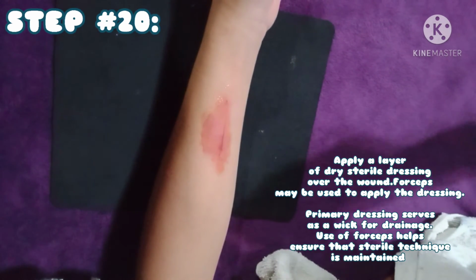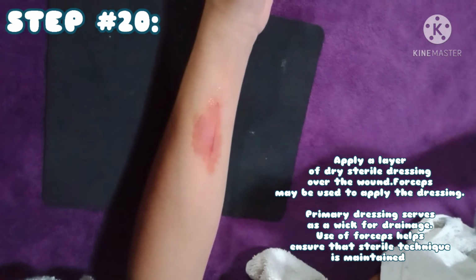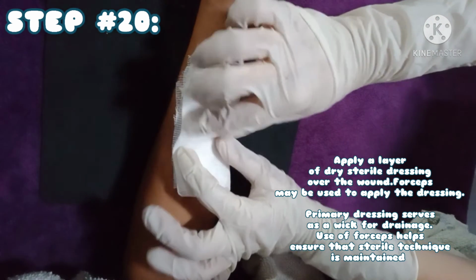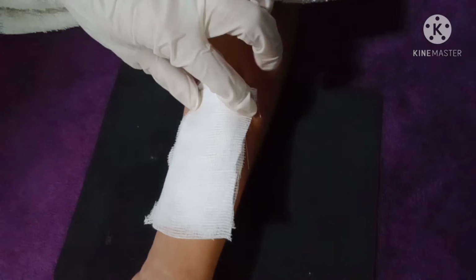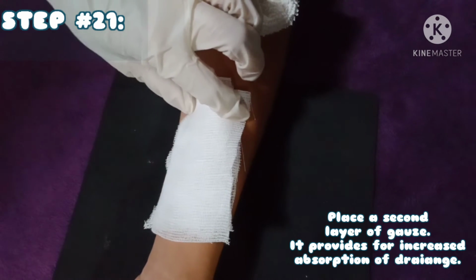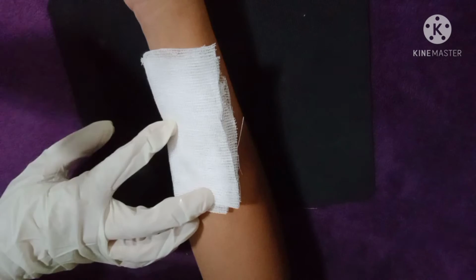Step number 20. Apply a layer of dry sterile dressing over the wound. Forceps may be used to apply the dressing. Primary dressing serves as a wick for drainage. Use of forceps helps ensure that sterile technique is maintained. Step number 21. Place a second layer of gauze over the wound site. It provides for increased absorption of drainage.